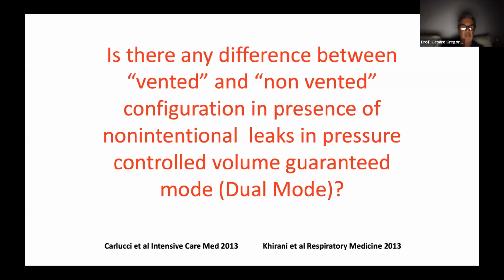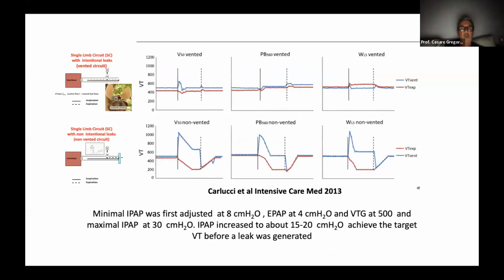An interesting study was carried out by our group, also by Brigitte Fauroux and Sonia Khirani in 2013, the same year. You can see the slide you have seen before. We have the same simulation: you produce leaks with the ventilators configured in vented or non-vented configuration.